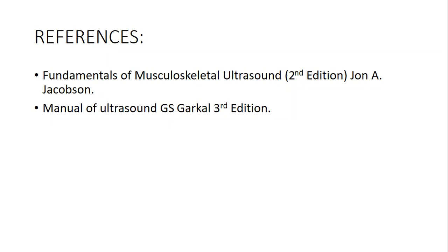Yes. Remember, sonographically and anatomically, we've got one structure that helps the elbow to flex, the common flexor tendon, and a common extensor tendon. So go to your elbow, which is in a flexed position, and go to your lateral portion. Don't even waste time. However, I should warn you, you may not find exactly the problem. But remember that you've got the common extensor tendon.